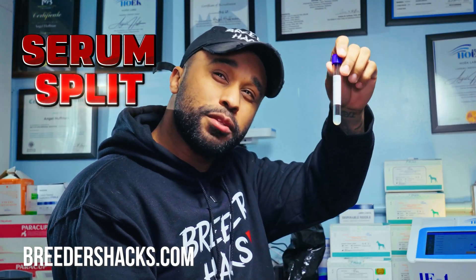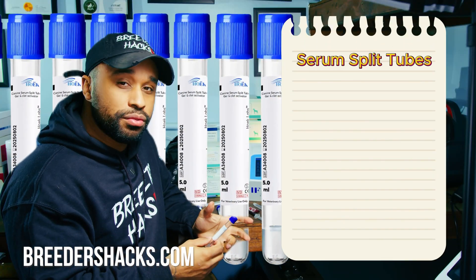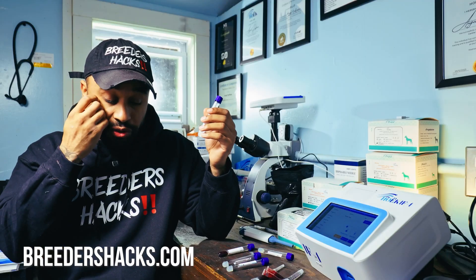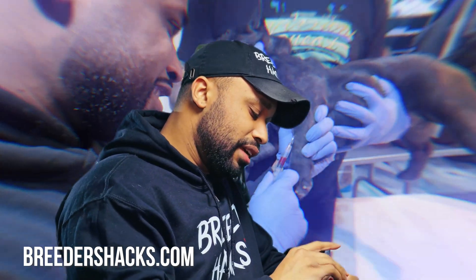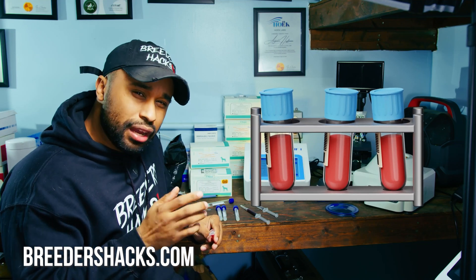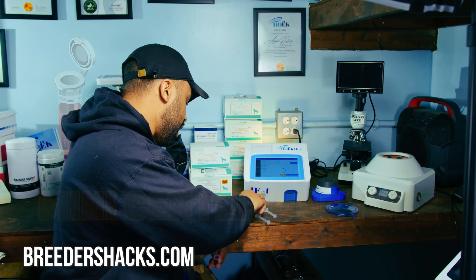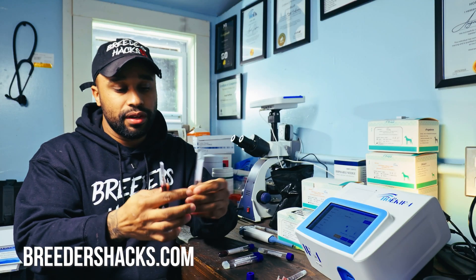I'm super excited to show you guys these — they're called serum split tubes. What's so dope about them is it removes the issue of getting really bad samples, getting clotted samples, your blood looking like jelly and not being able to perform the test. We have a dog that we drew blood from — I've got plenty of videos on the channel on how to draw blood — and we put some in the traditional tubes we used to use. We don't do whole blood anymore; it just didn't work out and we didn't get all that accurate results.